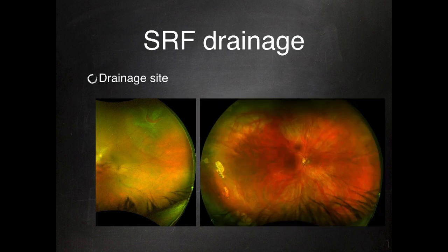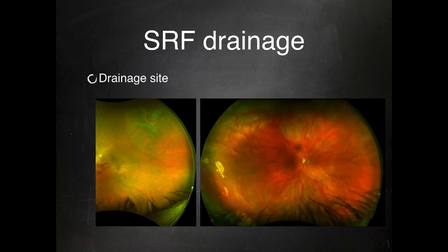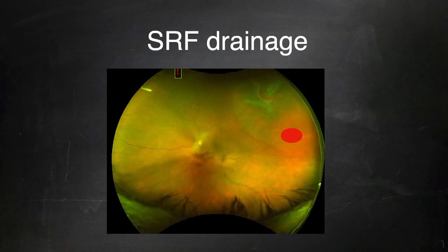When selecting the drainage site, you want to be at the most dependent part of the retina as much as possible. Another thing to consider is that the choroidal vasculature is dense near the vertical recti — the vortex veins are there — so you want to be more towards the horizontal recti.